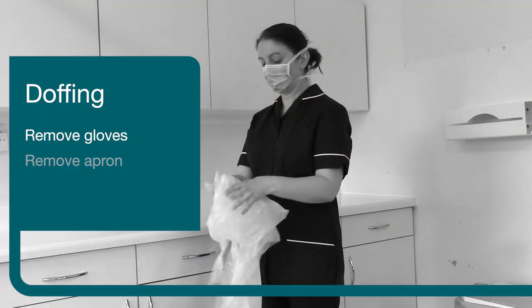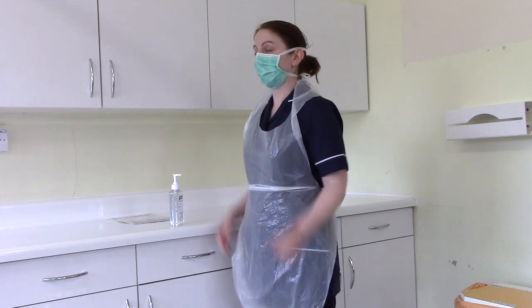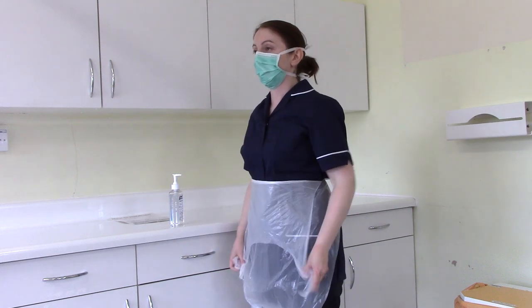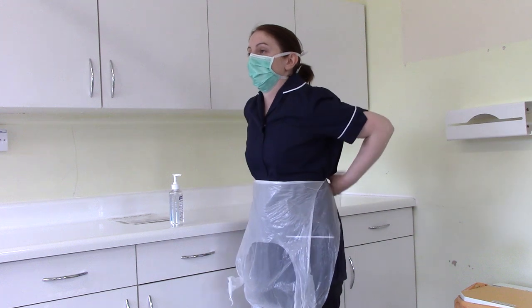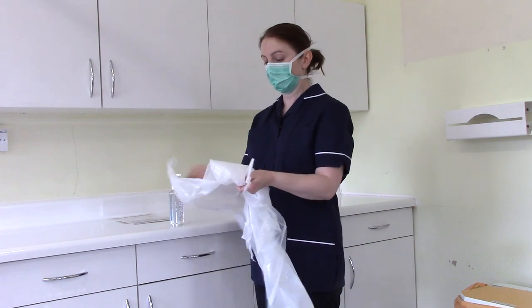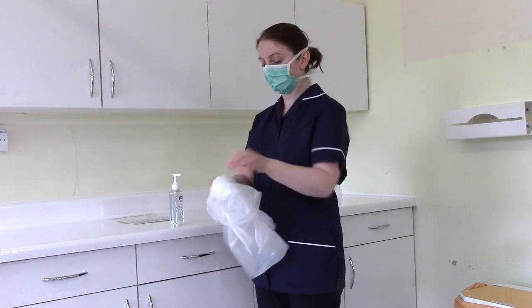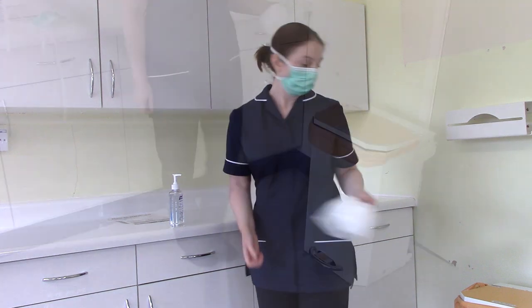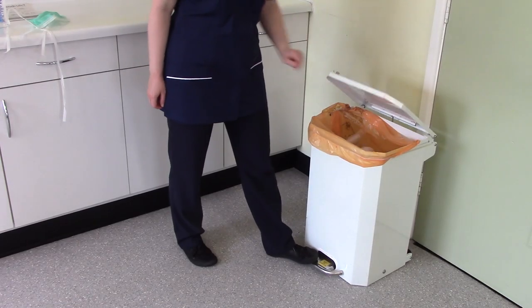Step two: remove the disposable apron. The outside of the apron should be considered contaminated. Break the apron behind the neck and pull away from the neck and shoulders, touching the inside of the apron only. Unfasten and break the apron ties at the waist and turn the apron inside out. Fold or roll the apron into a bundle, taking care not to touch the outside of the apron. Discard as healthcare waste.